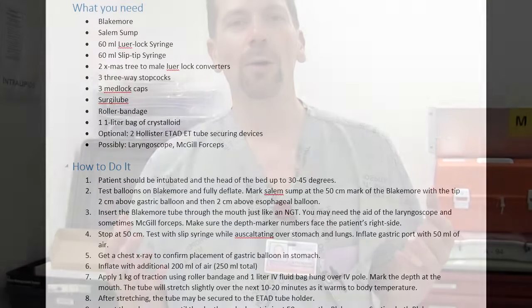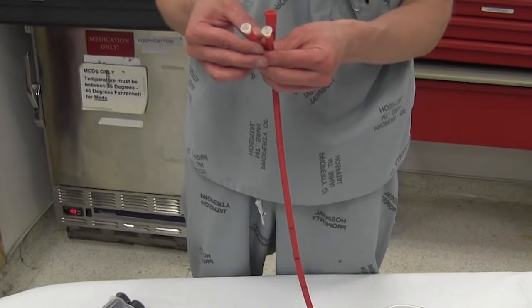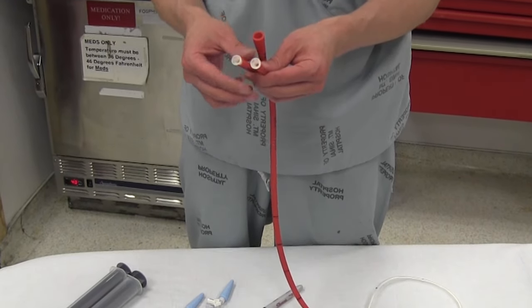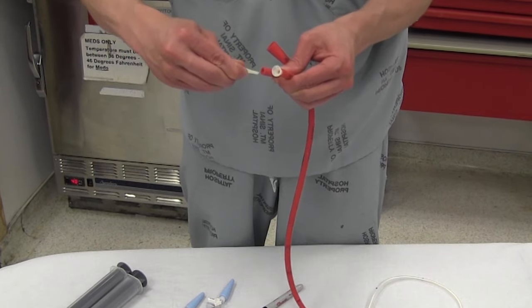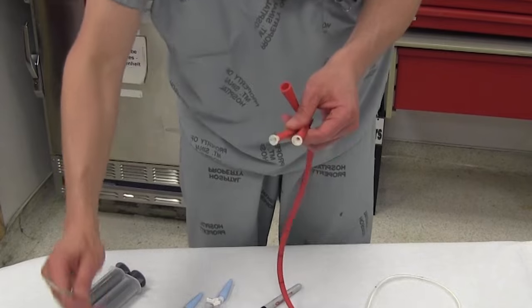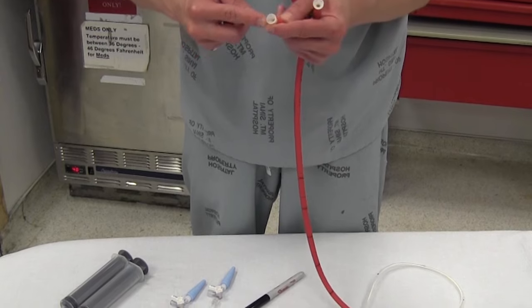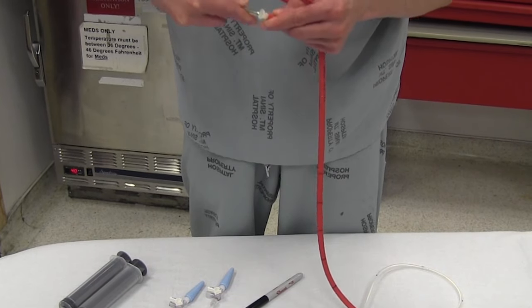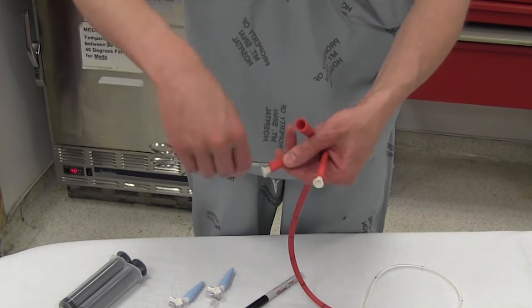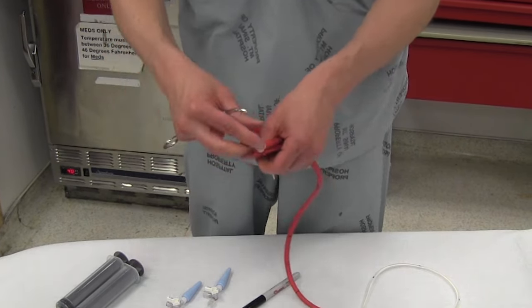Alright, so step one, we're going to do the setup — this is the equipment you need. When you look at your Blakemore, they come packaged with these plugs. These things are ridiculous. If it's been sitting for any length of time, they get wedged in there and you can't get them out. You've got to wedge a small kelly in between that plug and the Blakemore and run it around 360 degrees, and then the plugs will come out.